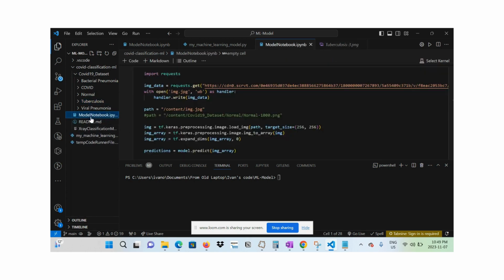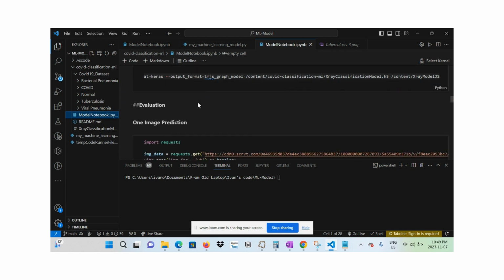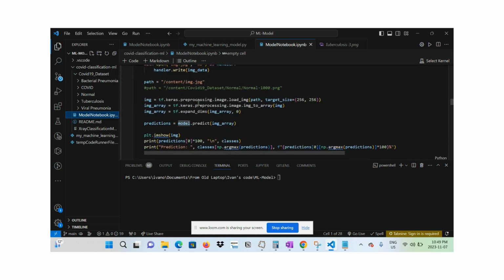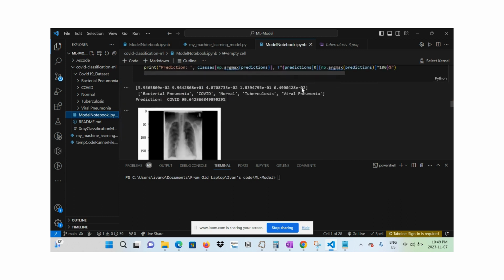So development of this model entailed gathering the data, so data sets from Kaggle, which is a machine learning space for image data sets, and GitHub resources as well, and then fine-tuning the model, pre-processing the model using already existing models that have been labeled and pre-processed, and then using feature extraction to extract the specific aspects of the model that we want to use for the detection. And of course, we need to set the images to a fixed pixel size so that all images are in the same proportion for the AI to understand, and so they can train with accuracy.